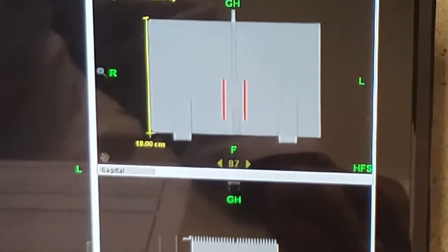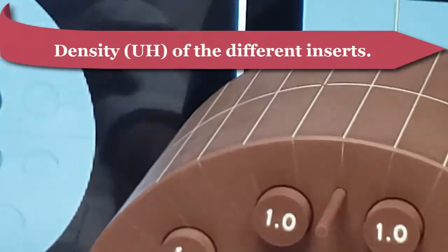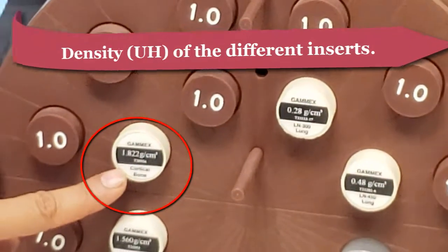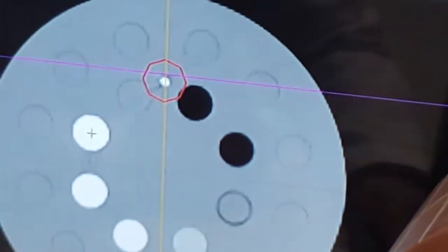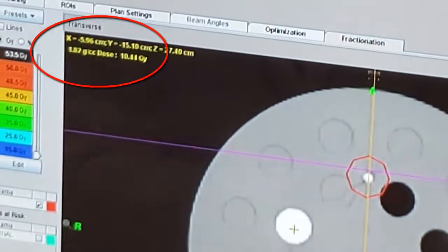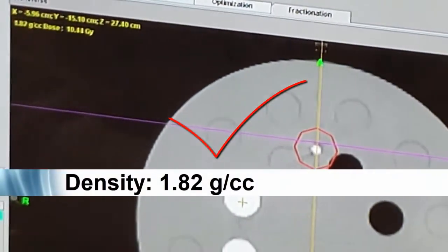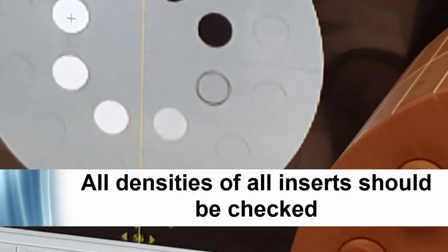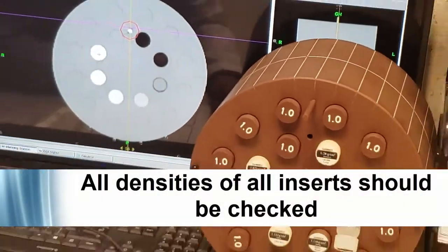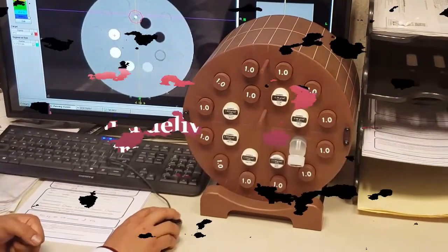Our system is working correctly. We are going to verify the HU. For example, this one shows 1.822. We look over here: 1.82. We are verifying that it corresponds with the HU or Hounsfield units and density.